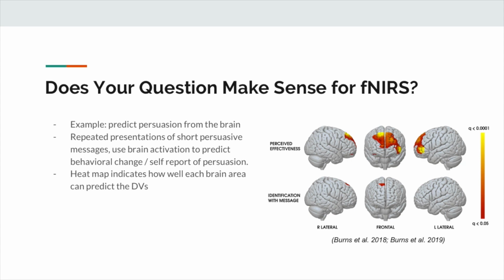Yeah. So how do you standardize the positioning of the optodes across subjects? I'll talk a lot more about that tomorrow. Briefly, you use what's called the external landmark 10-20 system. That is a system that's been worked out by EEG people a while ago now, where people's heads are different sizes, but most people's heads are proportionally very similar. So if you measure certain landmarks, like the nasion, in between your eyebrows, and the inion, which is this bump on the back of your head, you can then measure halfway between those, or a quarter of the way between. Each of those partial measurements is a certain landmark, and we use that system to standardize locations of our NIRS channels on people's heads.